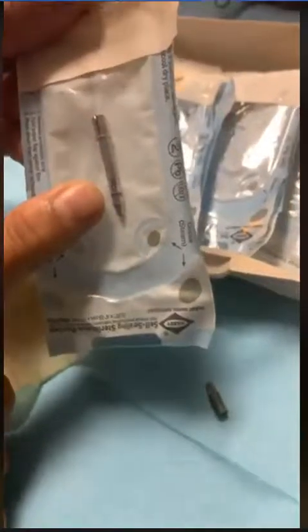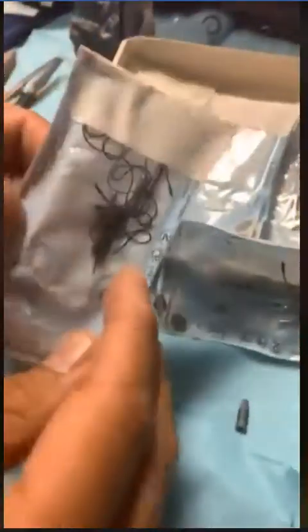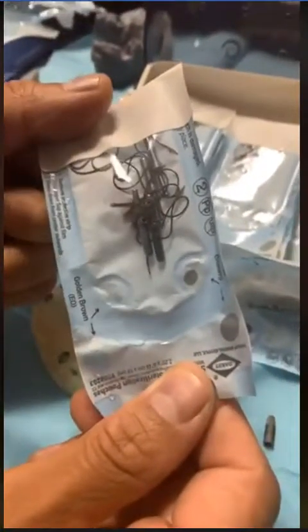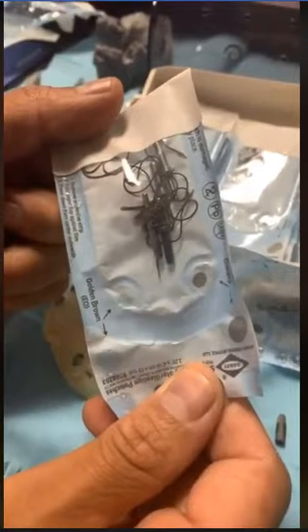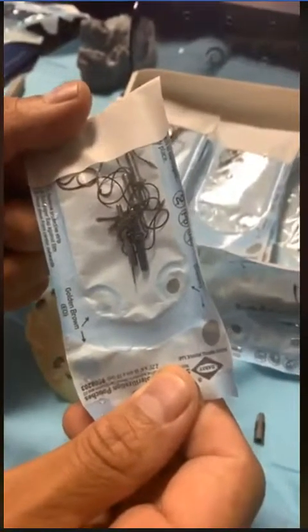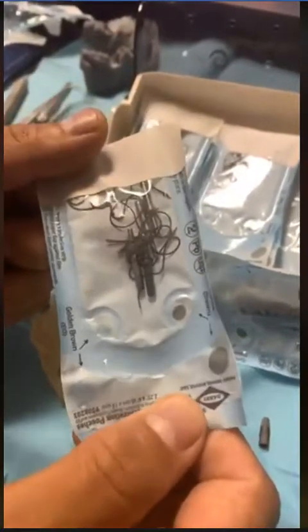I have another carrying tool that's not for guided, it's a non-guided. I keep it in here. I have a bunch of other burrs, different size burrs from other kits that I put there. But most importantly, I love my other paralleling pins that I can go through the entire surgery with. I don't care how many osteotomies you make, you can deviate from your original site if you do not check yourself on every osteotomy.